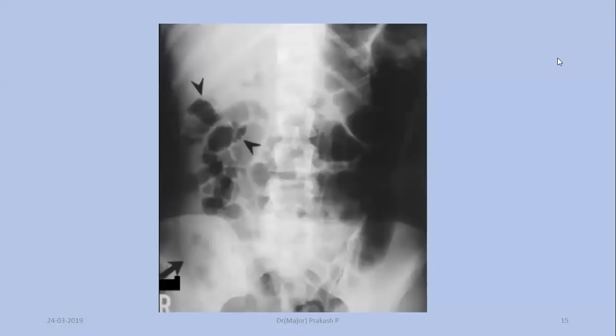Whenever you are seeing a barium study, whether it's a barium follow through or a barium meal, or for that matter, a barium enema, it is very important for you people to identify these basic structures. First, where is the pylorus located, how is the pylorus located. Second point, concentrate on where the C loop of the duodenum is. The third point, look for the cecum and the associated cecal structures. And if you get a very good quality image, look for the small bowel loops. Where are they located? So these are the four points which you pertinently have to see.